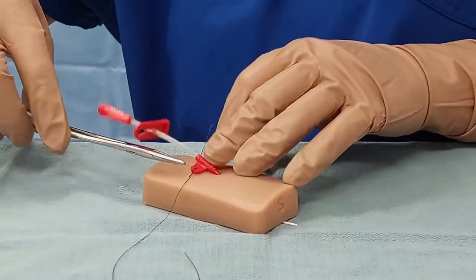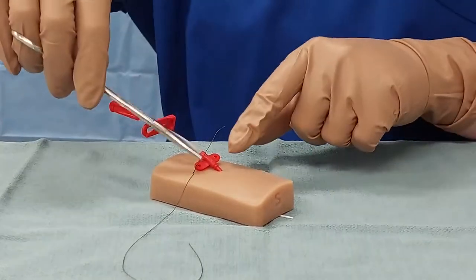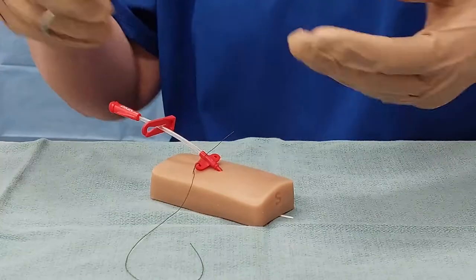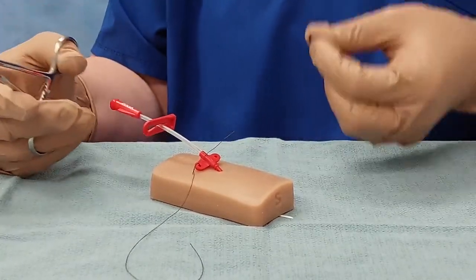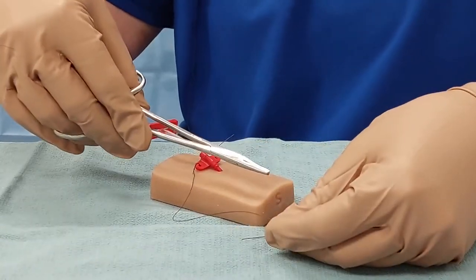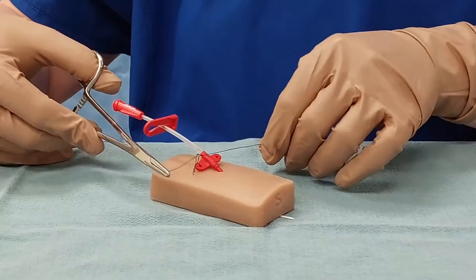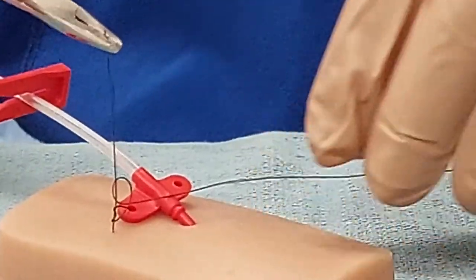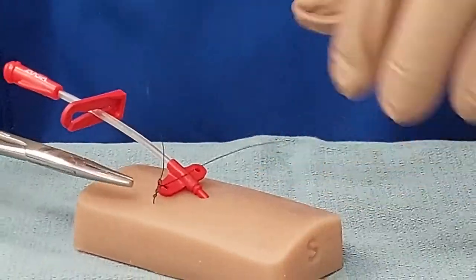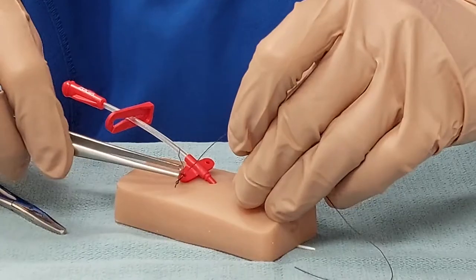You don't want this to be too tight — we're just trying to prevent the Artline catheter from coming out of the skin, so you can leave it a little bit loose. Put your needle drivers underneath to make sure you've got enough room so that when you tie your knots down, you don't end up pinching the skin. Check to make sure the skin's not pinched and not blanching. My needle drivers go over top of my knot again, I grab the end and pull it through with the twist on top, leaving it nice and loose. If you've completely twisted your material, pull that one out and start over.